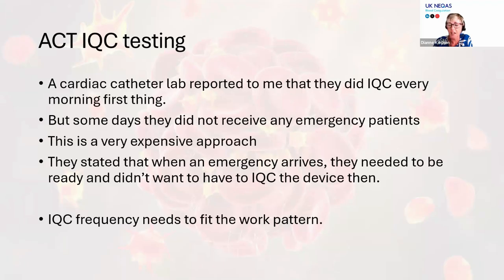Another example is from ACT IQC testing. This is from a cardiac catheter lab, and they reported to me that they would do their IQC every morning first thing, and then they would receive any emergency patients. But some days they didn't get any patients, so they'd run the IQC and not even done a test. And I explained to them that I felt this was a very expensive approach, but they said that they were completely happy with the cost of it, in that once a patient came in, they needed to be ready to go. They didn't want to have to do IQC or even then try and find a new machine if there was any problem. So they were happy with that.